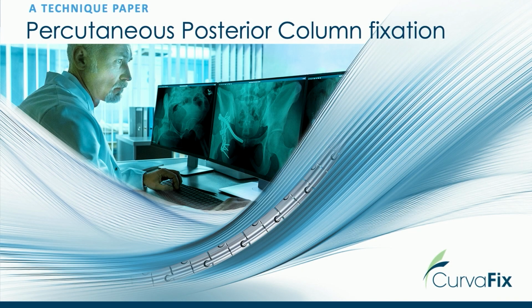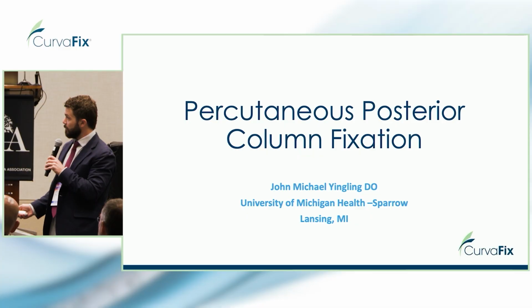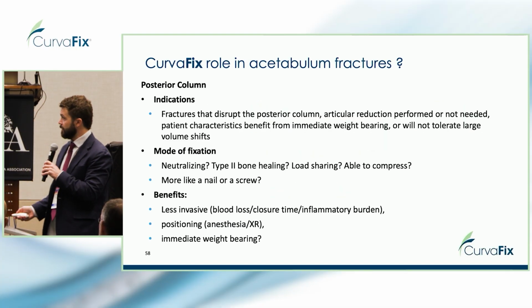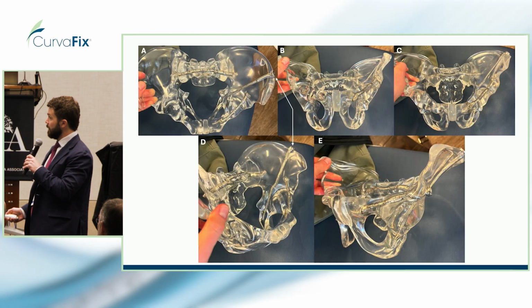John Michael Yingling, we're going to go over a technique paper we submitted. This is just a PowerPoint showing the technique for percutaneously fixing the posterior column with this curved intramedullary implant. We feel like there's a role for this in acetabulum fractures, as we alluded to.